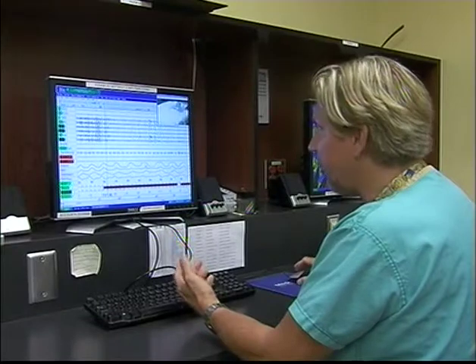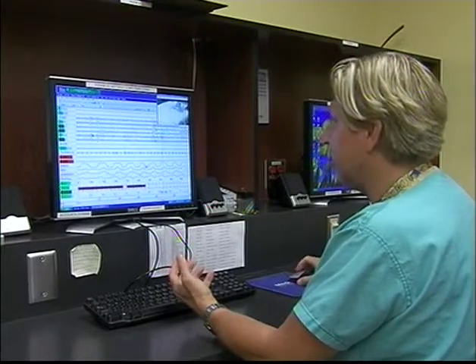The pressure is prescribed after what we call a treatment night in the sleep lab. You put it on while you're asleep in the lab, and the technicians adjust it by remote control to just that exact amount of pressure that holds the airway open so that you breathe easily and not excessive so that it's uncomfortable. So CPAP stands for continuous positive airway pressure, and BiPAP is 2 levels of positive airway pressure, bi meaning 2.